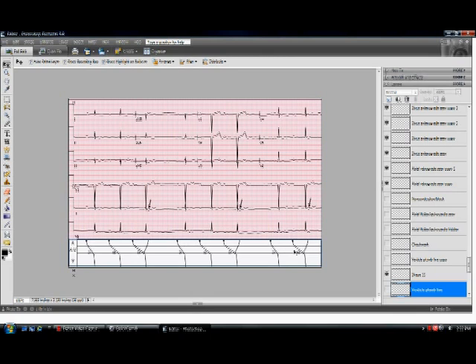There's an attempt at a type 1 AV block here, and you get AV nodal echoes when the PR interval reaches between 49 and 51. I hope that helps.